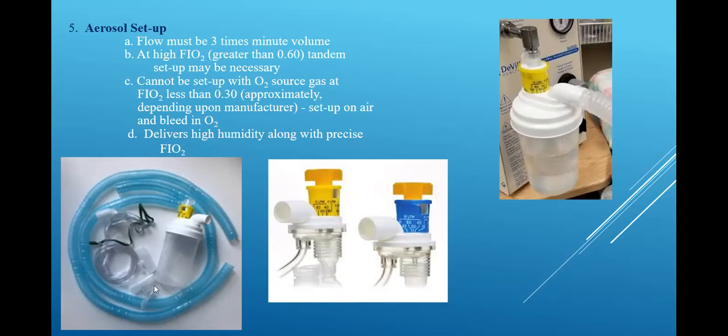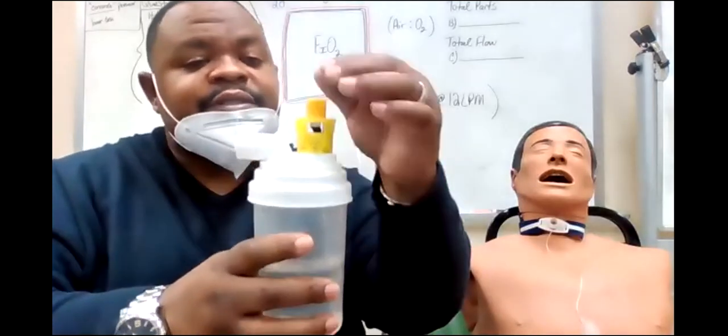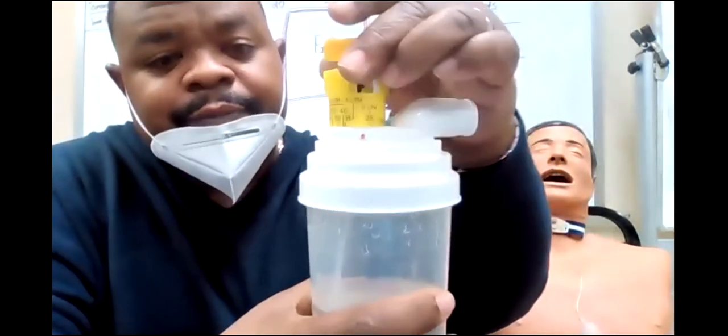Now we're going to set this up and I'm going to show you. This is the aerosol this, aerosol that, okay? Start out with your large volume nebulizer with water in it, okay? Remember, when I hook this up to oxygen, I control the Venturi ports to determine my FiO2, correct?